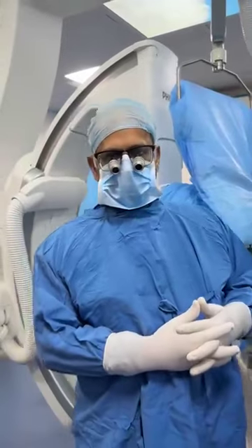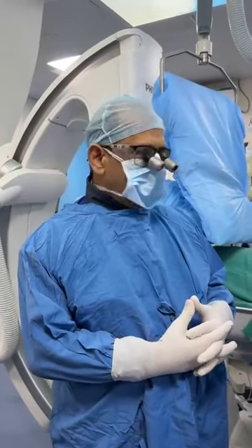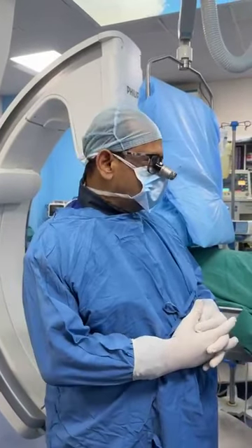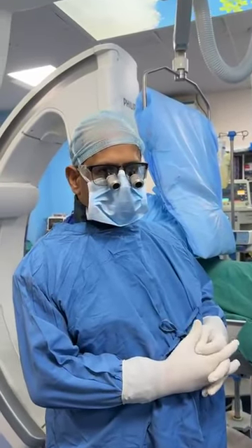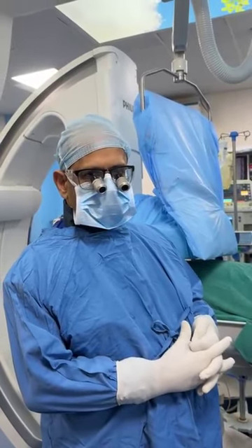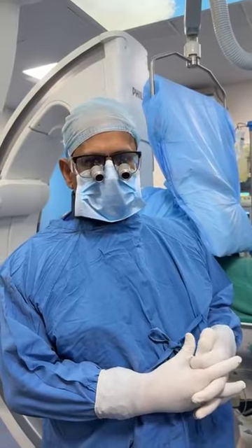Good evening. I am Dr. Karunakar Padhi, cardiothoracic and vascular surgeon, and we are going to do this complex hybrid procedure. The patient has come from Bangalore. He had an acute type B dissection and he was trying to fly back to Bangalore, but because of chest pain we advised him to stay here.